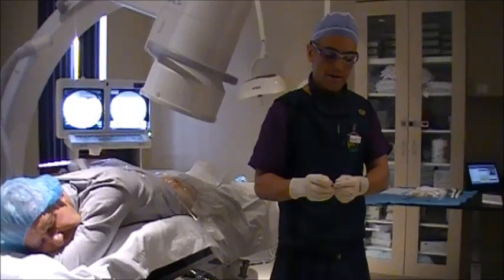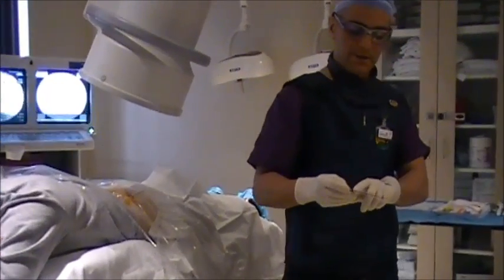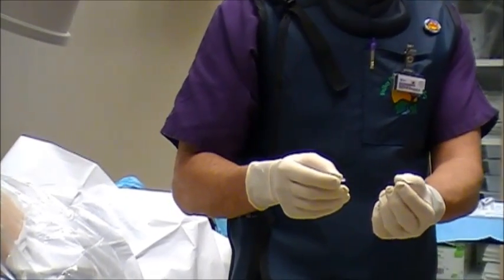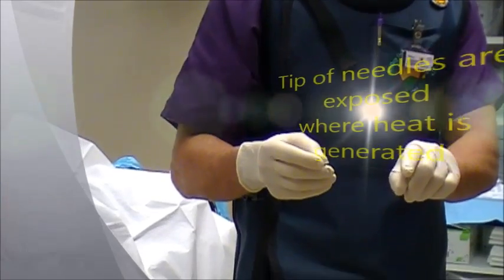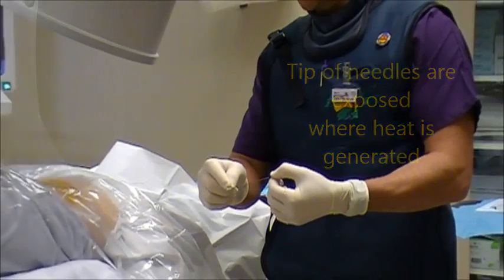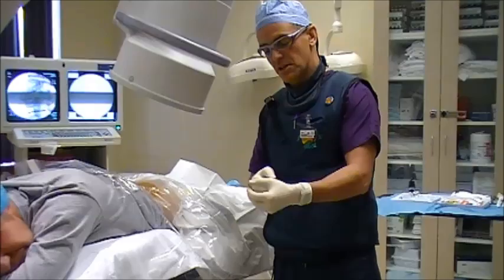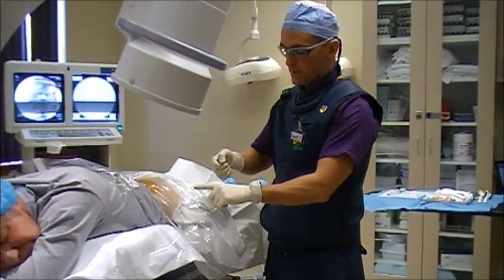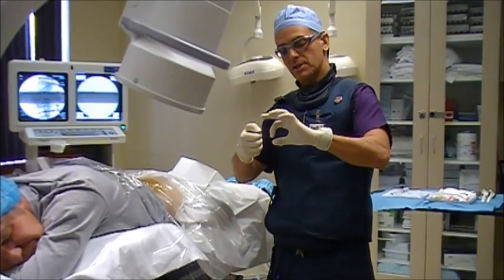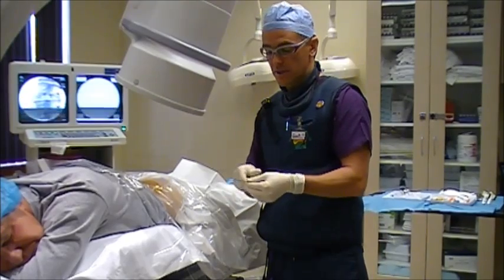Or cannulas that are specially designed, and I'm not sure if you can see this or not, and perhaps you can turn the light on, and you'll be able to see that the needle is insulated with a silicone type of medium, and the tip of the needle is exposed. And so what will happen is the needle will be placed, and the tip of the needle will emit a radio frequency signal which will heat up the surrounding tissues, and this section of the needle will get hot. So if we're able to place this section of the needle next to the nerve, we'll create a burn or a lesion or a cauterization about 3 millimeters circumferentially outward from the side of the exposed tip of the needle.